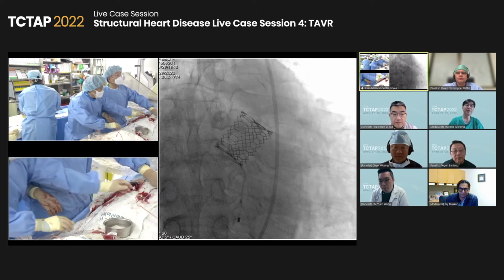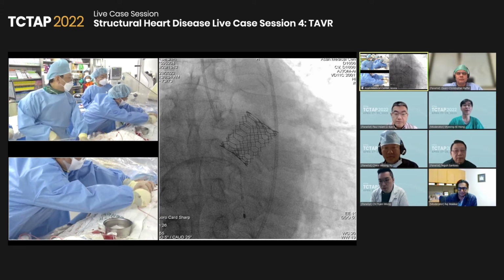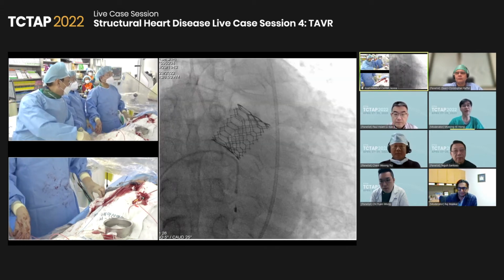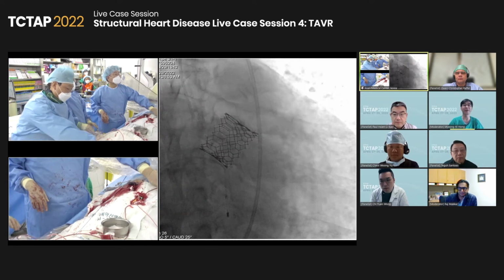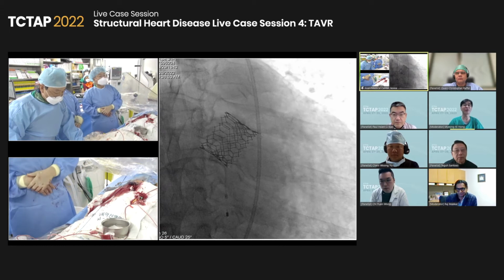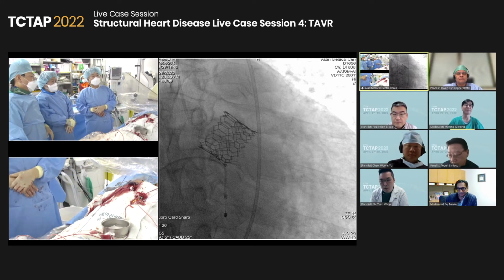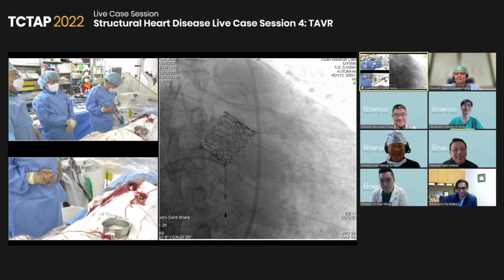And we're gonna show the aortogram again. Finally, all right. I'd like to make one comment about the aortic regurgitation. The echocardiographic finding is no regurgitation, and hemodynamically it is perfect. So it should correspond to the angiography appearance. So it is very interesting. What appearance in the final angiogram? All right, I will show you. Very interesting.